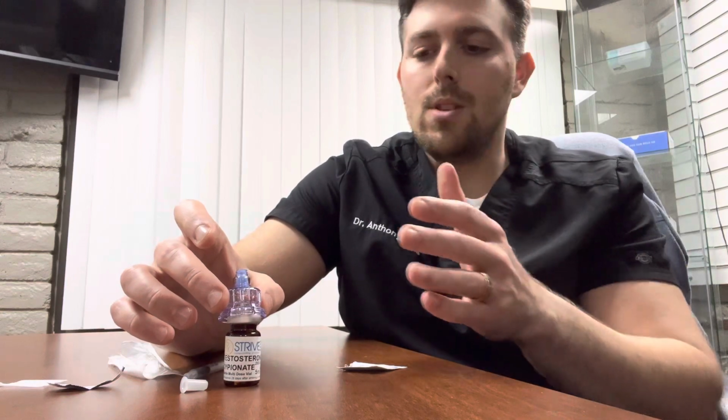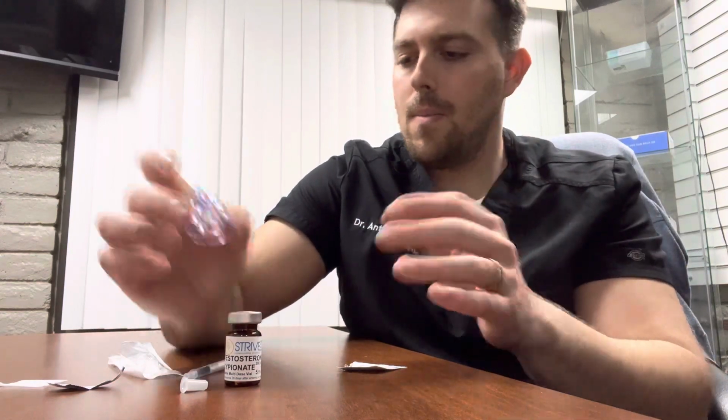You can put the needle on it there. The Swan Lock topper will remain on top of the vial, just like this, and you can continue to use it until the vial is complete.